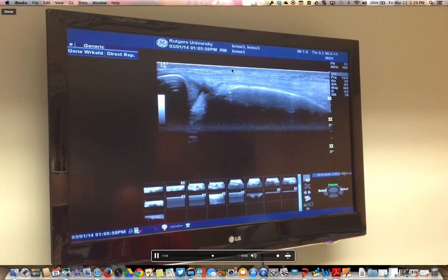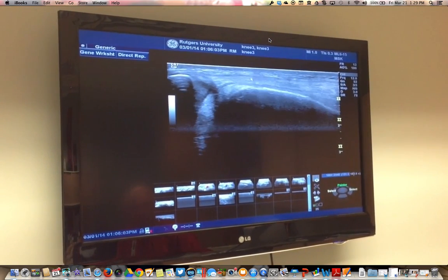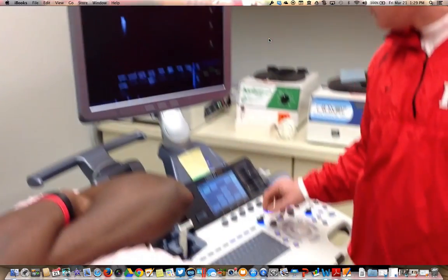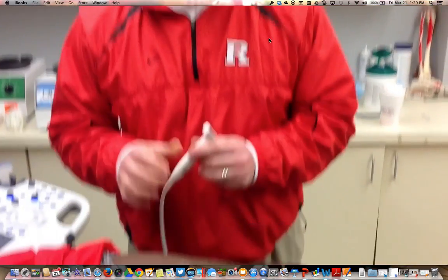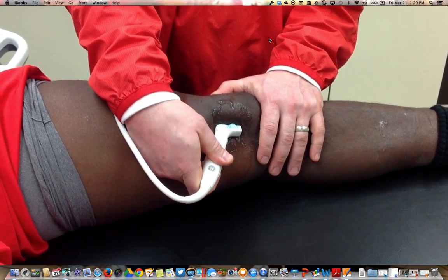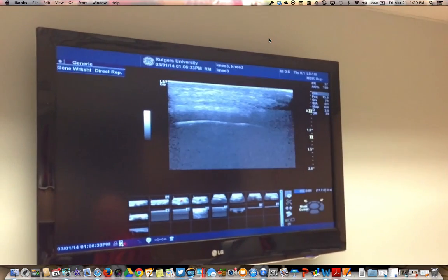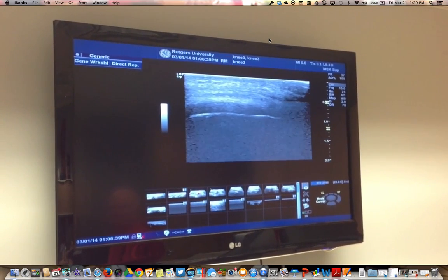So here, again, the lateral retinaculum coming and attaching to the patella, coming all the way across on that. In addition, we want to look at the articular surface of the patella underneath on the medial aspect. This is better looked at using the hockey stick probe. What I do in this case is bring the patella over medially, place the probe directly underneath the patella by tilting it, and then get a view where you can see the hypoechoic cartilage underneath with the hyperechoic patella.